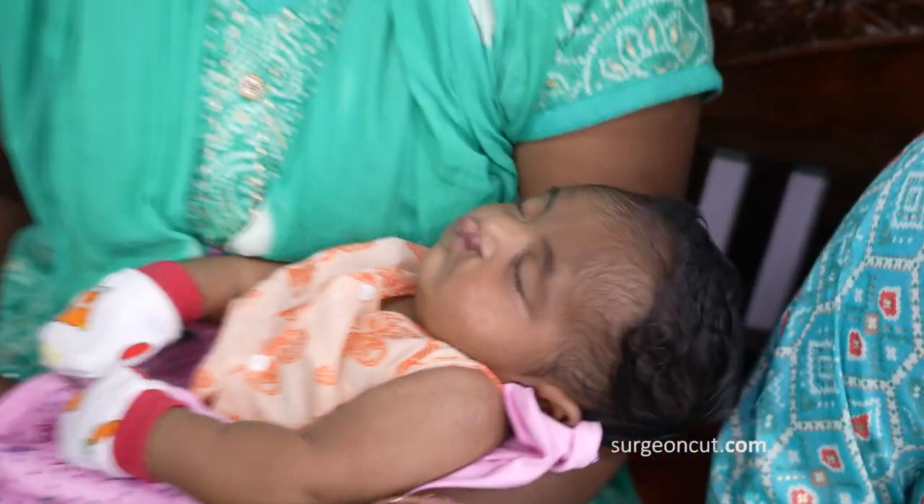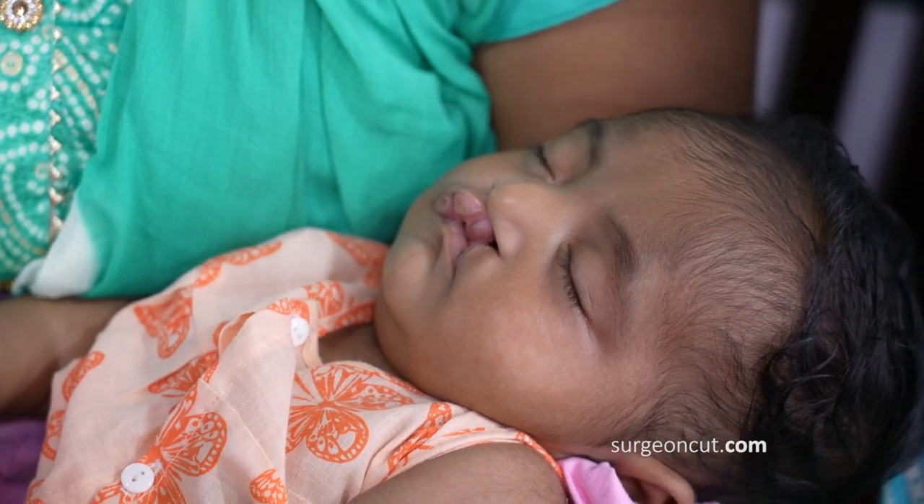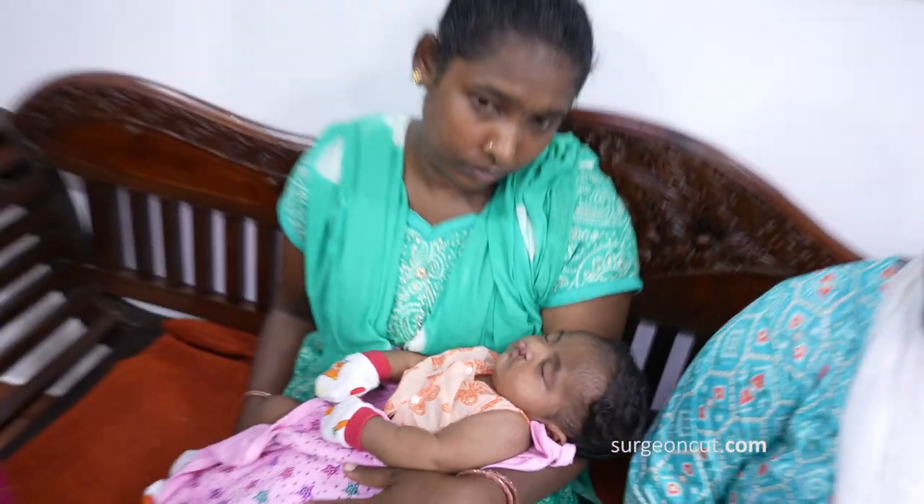So it's going to be a proper cheiloplasty. When the baby is about 9 or 10 months of age, we'll schedule the baby for a palate repair.